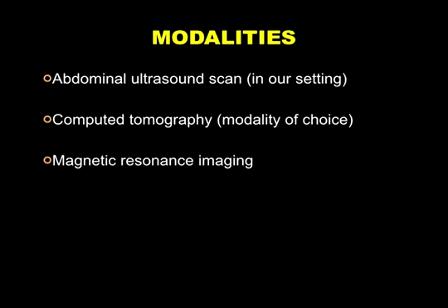We do abdominal ultrasound scan. And in the pediatric setting, because of the fear of radiation, this is the modality of choice. And in our setting, many of our centers don't have CT scans and they don't have MRI. You can locate big masses using ultrasound. CT, if we can access it, just like we do in Mulago, is the modality of choice. We have to be prudent enough to scan our patients right from the diaphragm to the pelvis if we are looking for the abdominal paragangliomas.